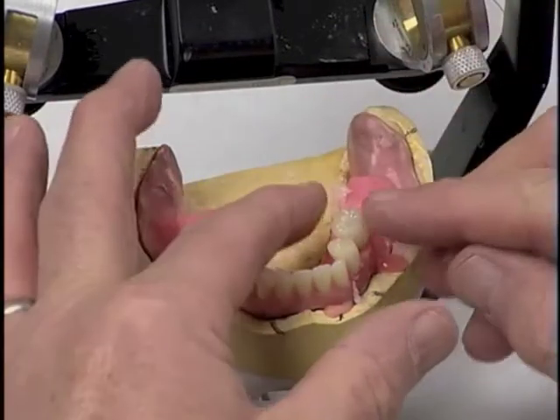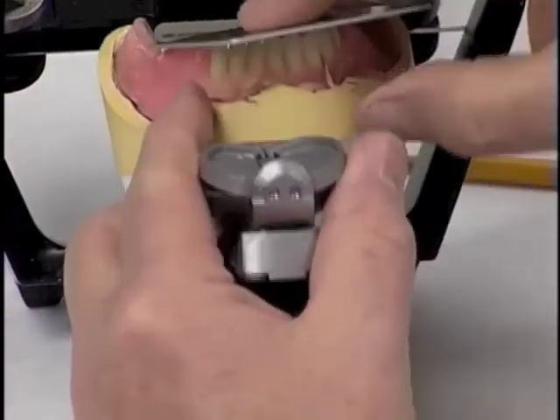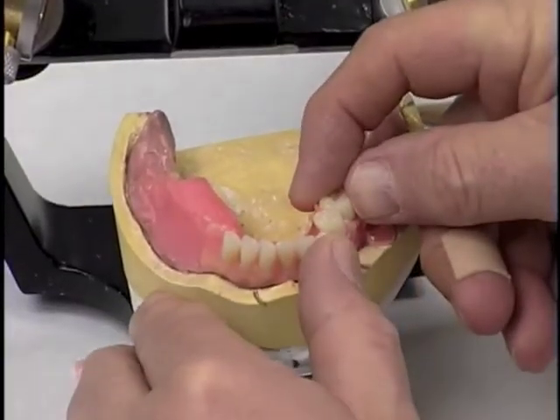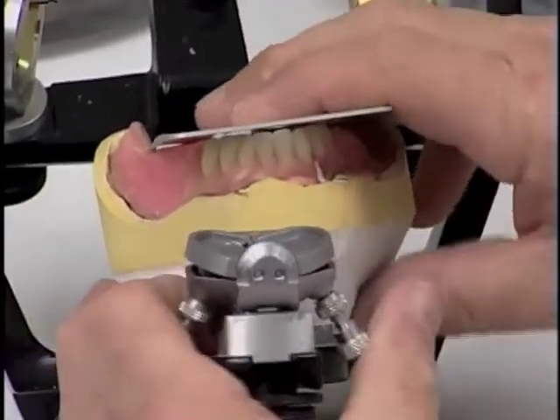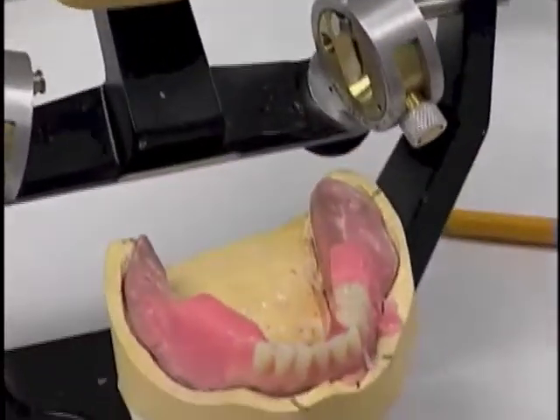And so we place the tooth where we think it belongs, and we take our occlusal plane guide. And with that occlusal plane guide, we mash the tooth down to get it into position and check to see that all cusps, both buccal and lingual, are touching. And that seems to be pretty good.